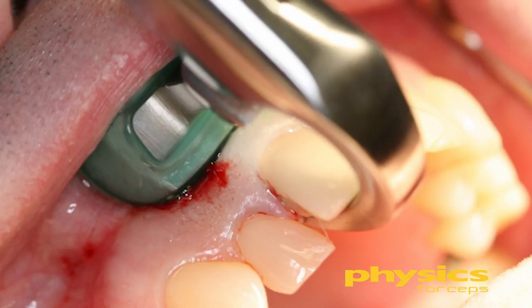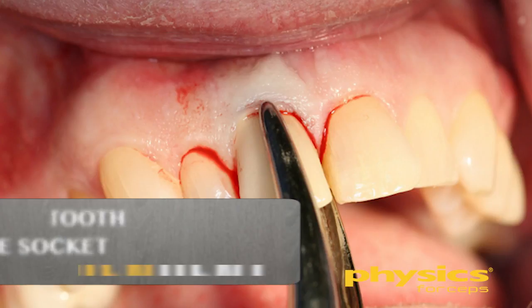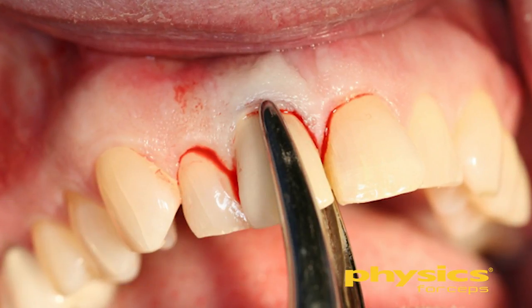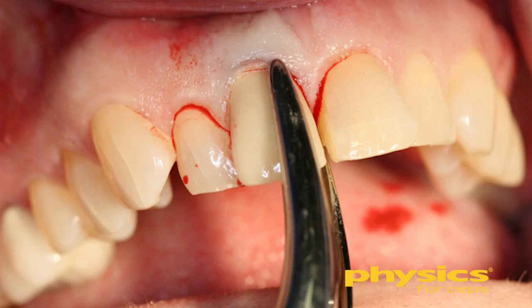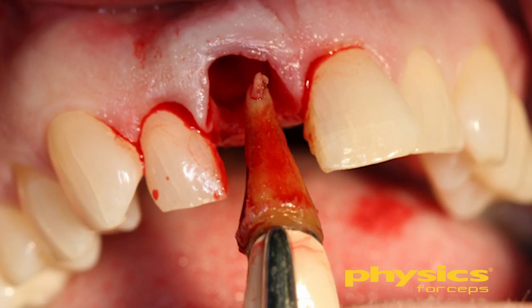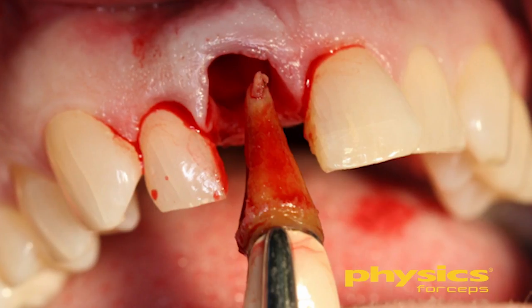The instrument is not intended to remove the tooth in total — it's intended to luxate the tooth one to three millimeters up and out of the socket. Then I'll take my bird beak tooth delivery instrument, grab onto it, rotate it, and simply remove that tooth right out of the socket. You can see we had a long skinny root and we have an outstanding atraumatic extraction where the patient doesn't feel it because there's no force being put on it — we're not squeezing the instrument and not harming the patient at all.